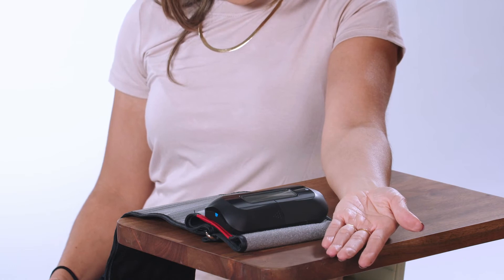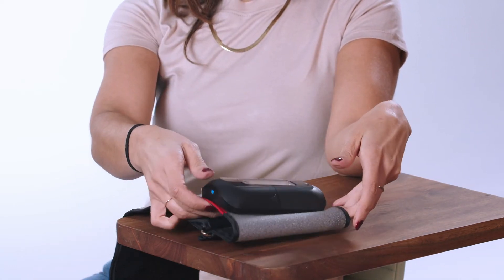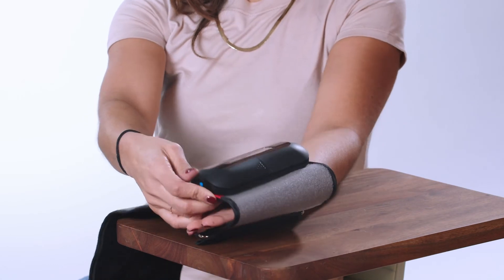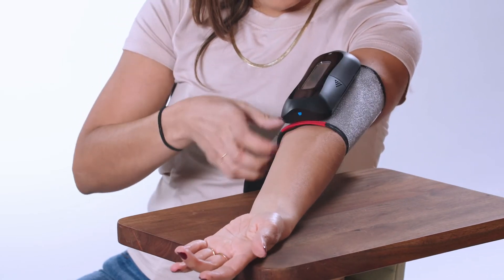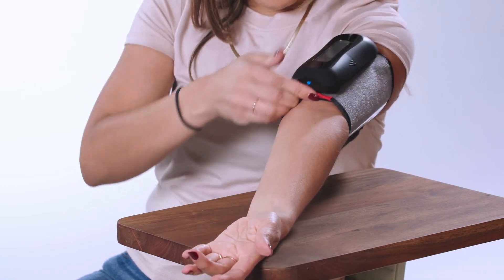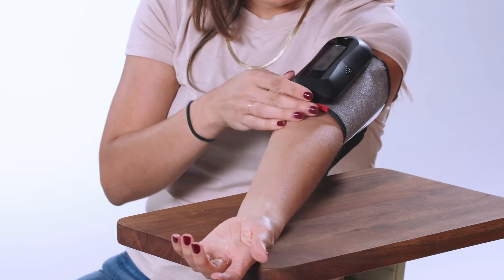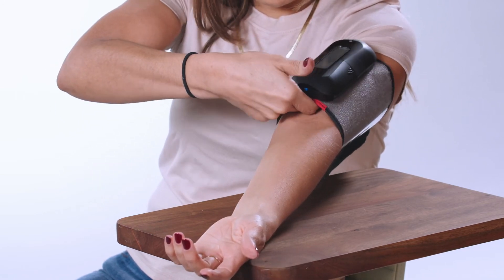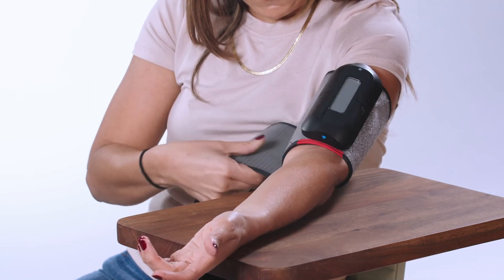Rest your arm on the surface with your palm up, maybe on a pillow to make it more comfortable. Make sure your elbow is at the level of your heart. Place the blood pressure cuff on bare skin, not over clothing. Align the red line on the cuff so that it sits an inch above the elbow crease. Adjust the velcro so the cuff is fitted evenly on the upper arm, making sure the width of two fingers can fit between the cuff and the arm — not too tight or too loose.